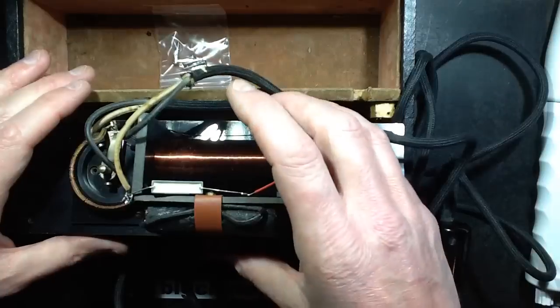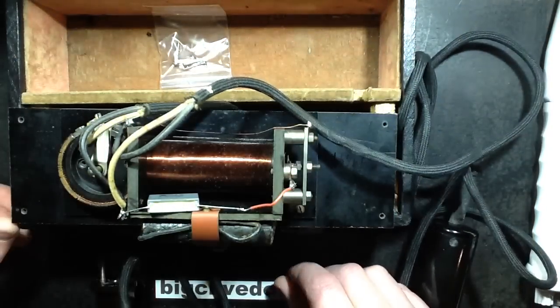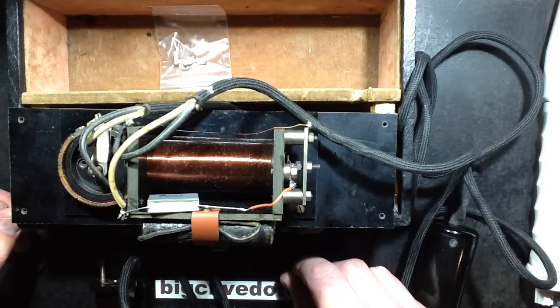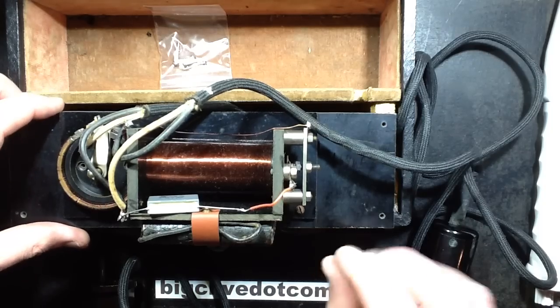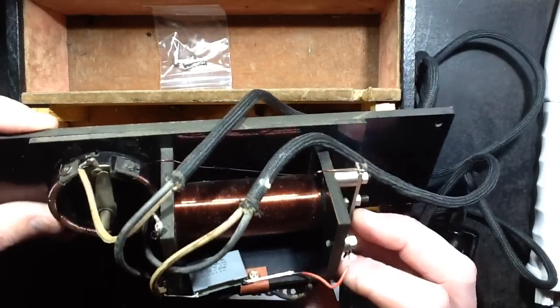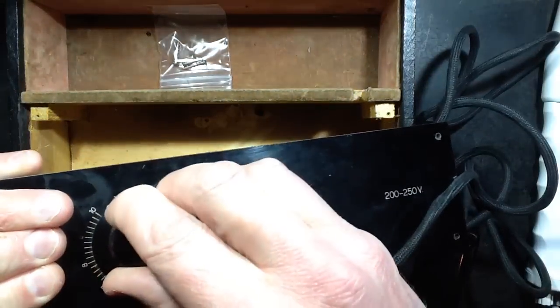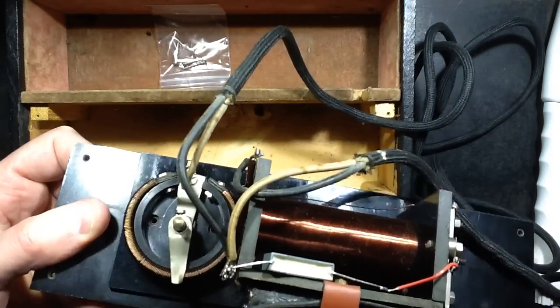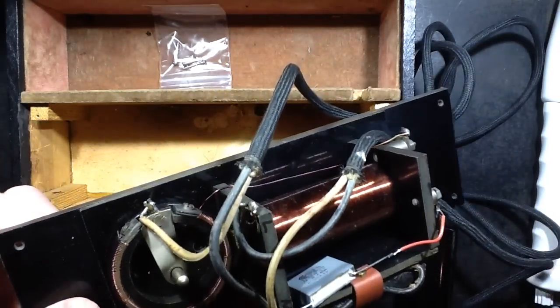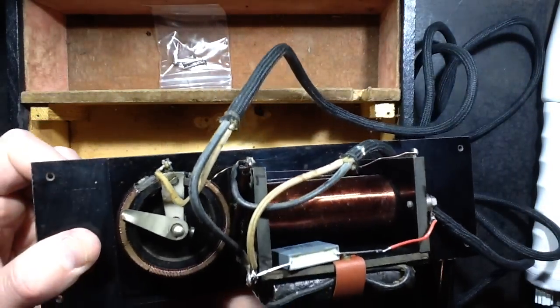Put in a 220 nanofarad capacitor, solved that problem and turned it into a somewhat over-energized unit. It was quite a vicious and violent spark coming off the end. And after that, the only thing that's actually in the circuit is this. It looks like a rheostat, but it's actually a variable inductor.